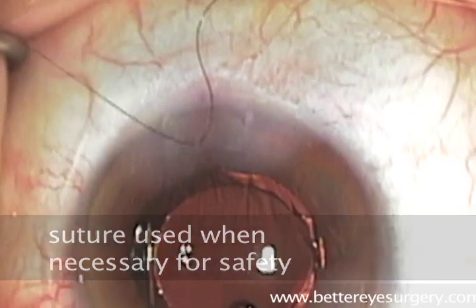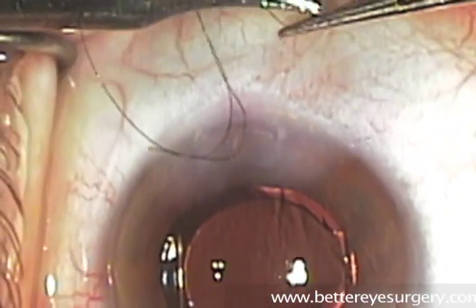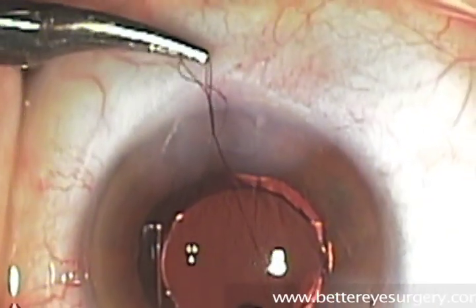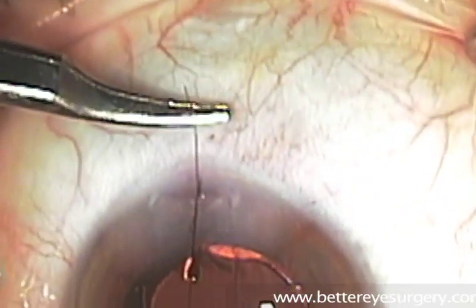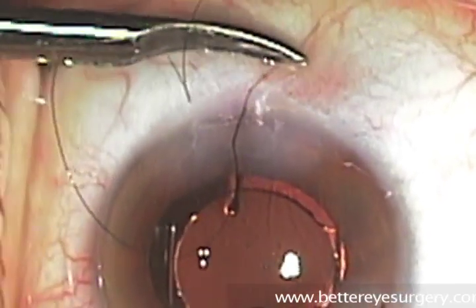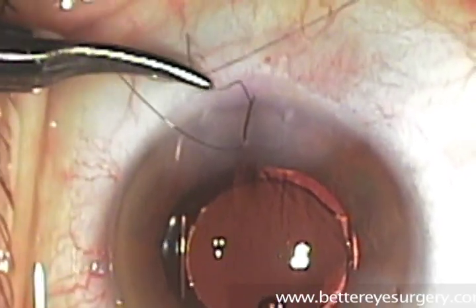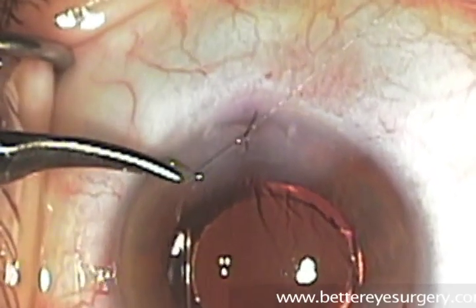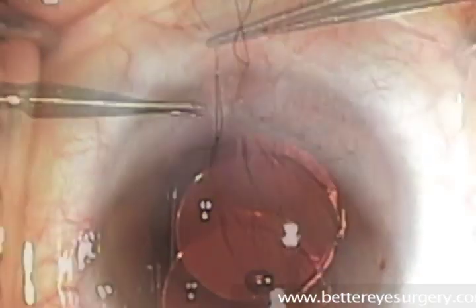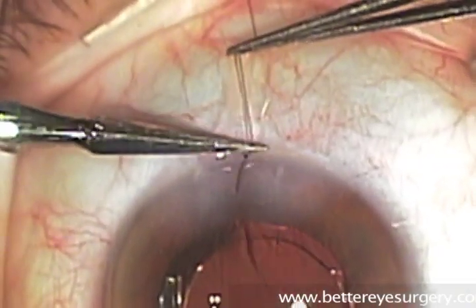Occasionally we put a suture in the main incision just to be absolutely sure that the wound is sealed, so that the lens will stay in its proper position and all fluids will remain inside the eye and nothing from the outside will get in. This simple step takes just a moment and the suture will be removed the day after surgery. Occasionally it can cause some irritation on the day of surgery, but is otherwise very innocuous and well tolerated.